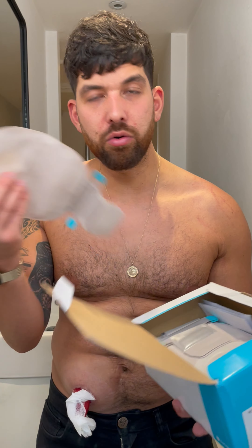I can't control how active it is, so although during this video it hasn't been splurting out, there's nothing stopping it from doing that — it can be active whenever it wants. Now that I've done the whole process of changing my bag, cleaning the area, and making sure there's no sores or discomfort, I then look to put my bag back on. It's really important that this part is quite a quick process.